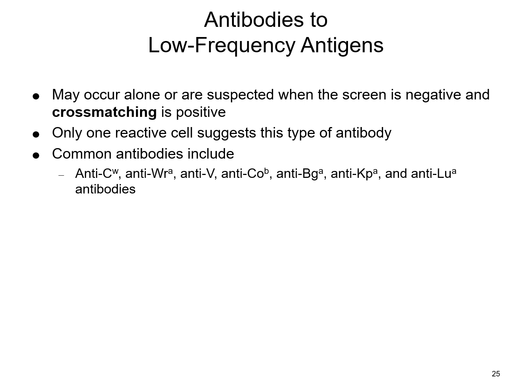A lot of places have switched over to doing electronic cross matches now, but I'm still a little old school. I still like to put my eyes on it, and I still like to see what it looks like in the tube before I give it to the patient. So doing a cross match, whether you do it in tube or automated or some other method, is going to give you that self-assurance that you are providing the safest possible product.